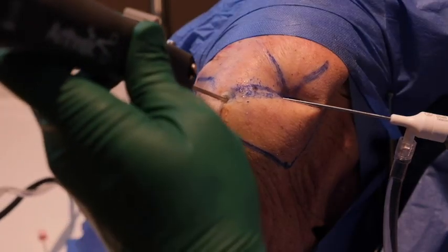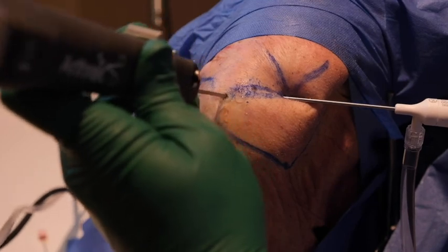After using the soft tissue shaver, a high-speed 3 mm burr is inserted percutaneously to remove 8 mm of the lateral end of the clavicle and complete the procedure. The known diameters of the shaver blade and burr are used as references to evaluate the amount of bone that was resected.